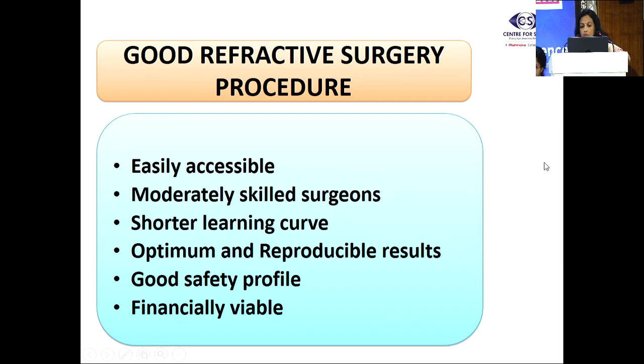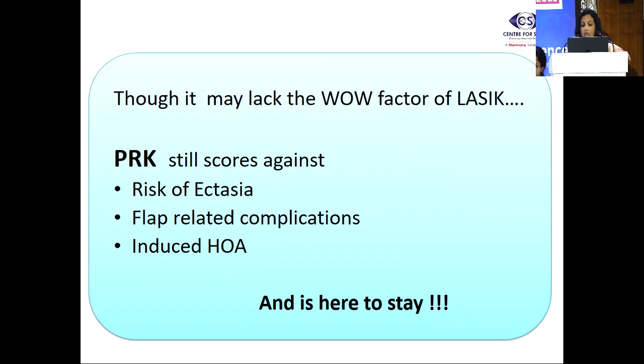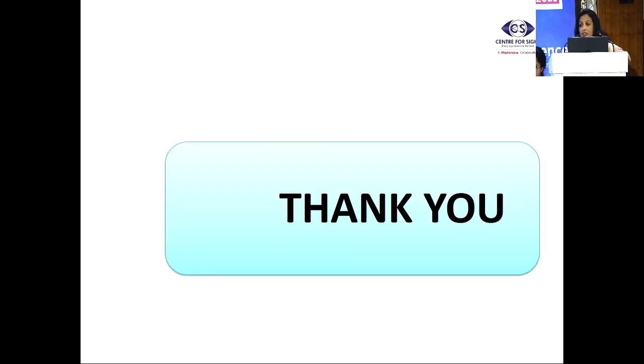So the take home message is a good refractive procedure is one which is easily accessible. A moderately skilled surgeon should be able to perform it with a shorter learning curve, and it should give optimum and reproducible results with a good safety profile, and it should be financially viable. So though PRK may lack the wow factor of LASIK, it still scores against the risk of ectasia, flap-related complications, and induced higher order aberrations. And I would say it's here to stay. Thank you for your patient listening.